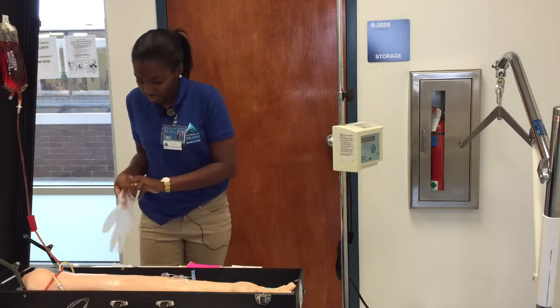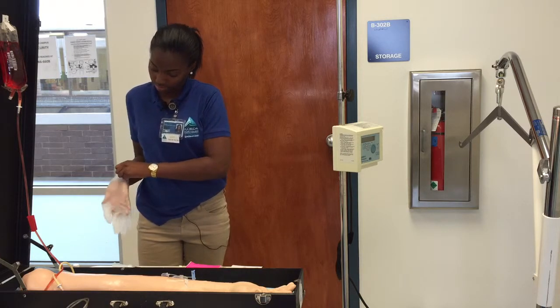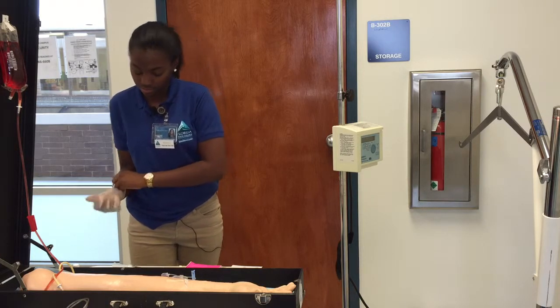And a number of attempts, as well as any instructions that I gave the patient. I'll just calculate the minutes. Looks good.